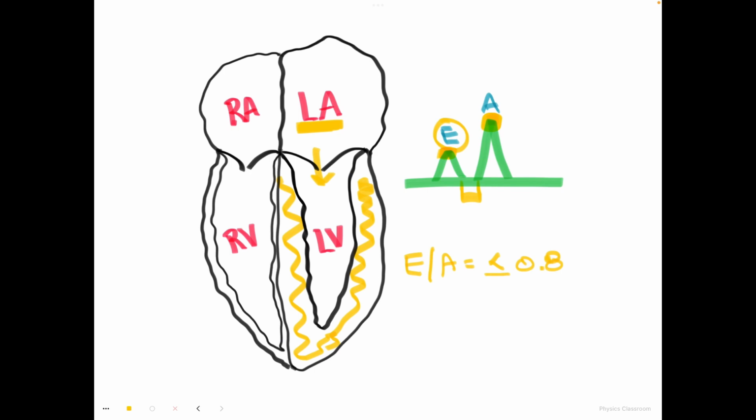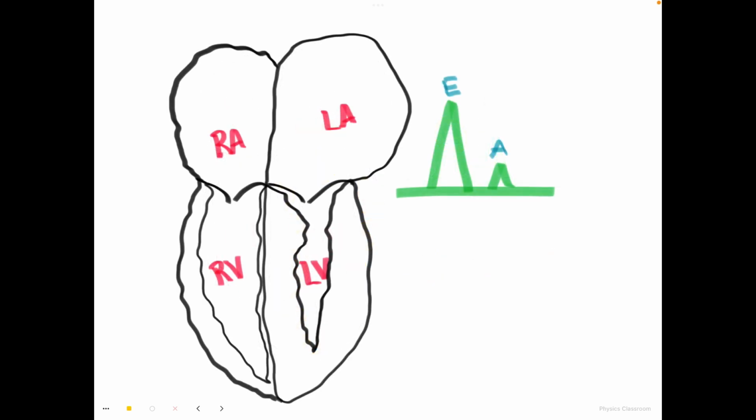And lastly, we're going to be talking about our late stage diastolic dysfunction, or our grade 3 diastolic dysfunction. So as you can see, your LA has expanded beyond what it should, right? It is volume overloaded, it is pressure overloaded over a long period of time. It's not happy. So your pressure in your LA is far beyond what it should.